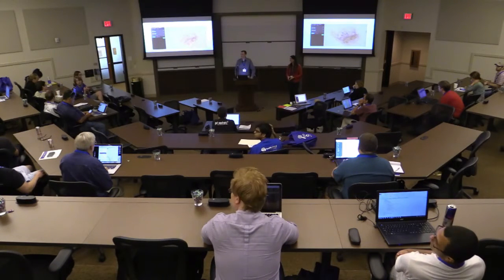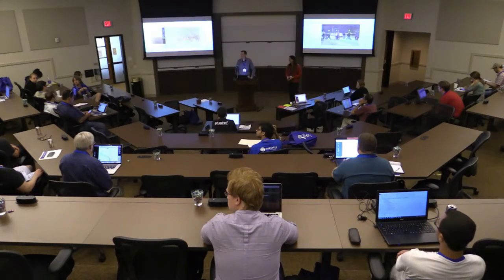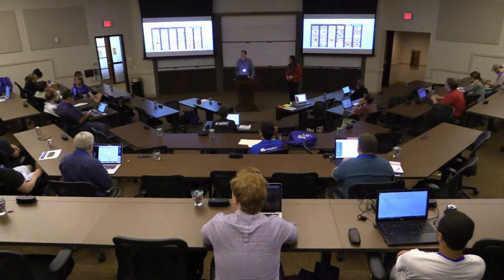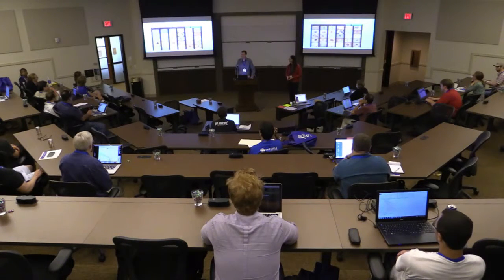Okay. So one of the slides you showed had all the grid of images available to choose from. Yeah. Have you attempted any white balance as a pre-processing step? Because color is hugely important to the dermatologists.